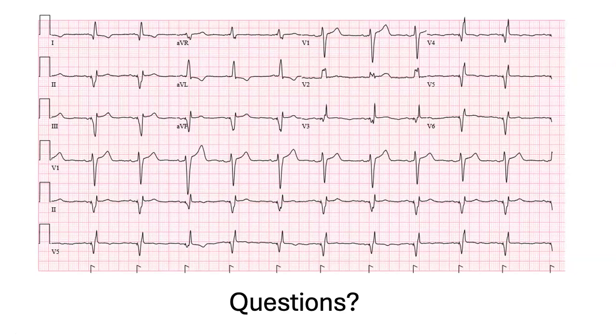Gerard has got a question. One thing on that statement, I've actually seen the inverse effect where extending the pulse width and lowering the voltage is more beneficial. So just try whatever options you have, because it doesn't mean you have to abandon that vector or not use the LV lead. It just means that there's maybe some programming you can do.